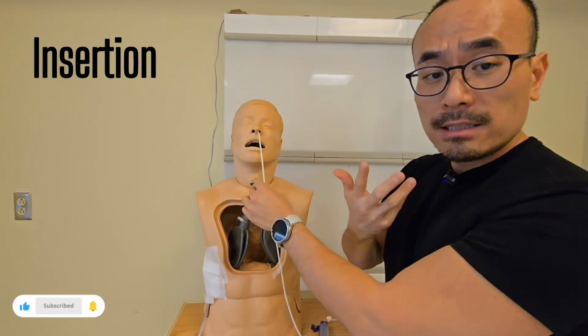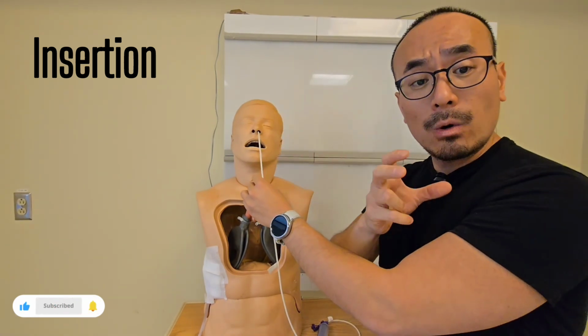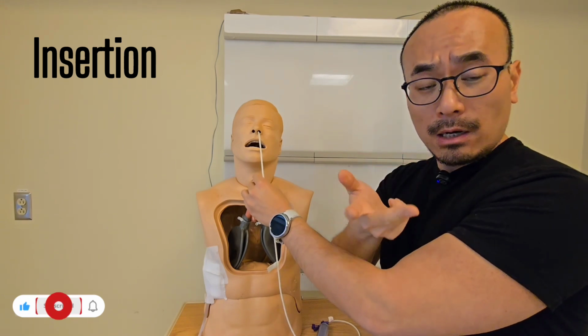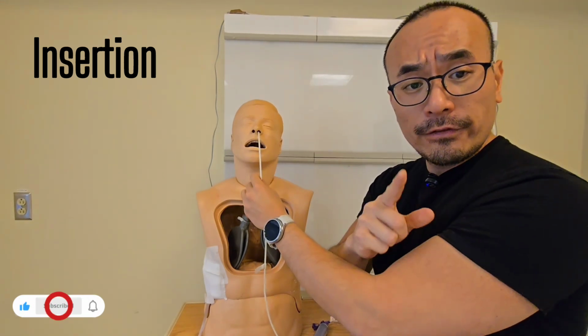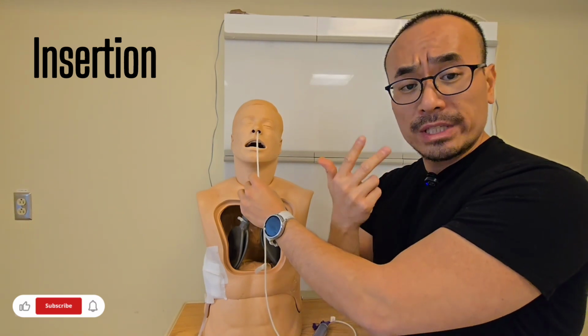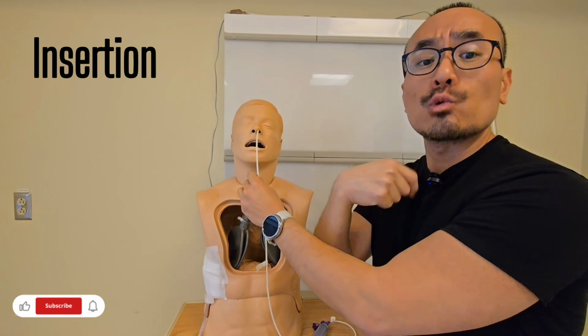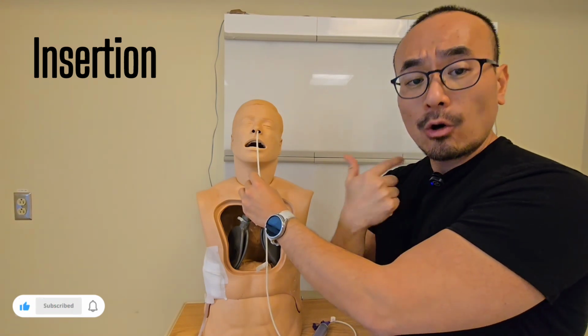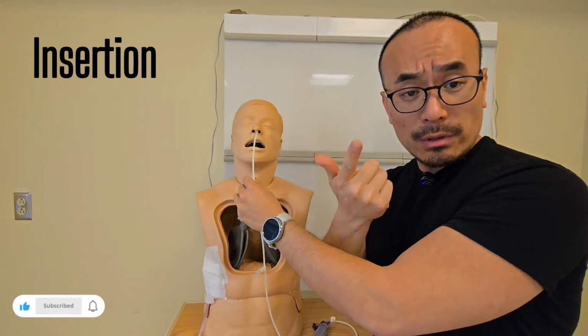At this point, you can ask the patient to start swallowing, or you can give the patient a straw with a cup of water and they can sip water. As they sip water, you advance the tube. If your patient is fluid overloaded, for instance, patients who are CHF, you can give them a straw and you can ask them to suck and swallow on the air, because that will still open the epiglottis, allowing the tube to go into the stomach rather than into the lungs.